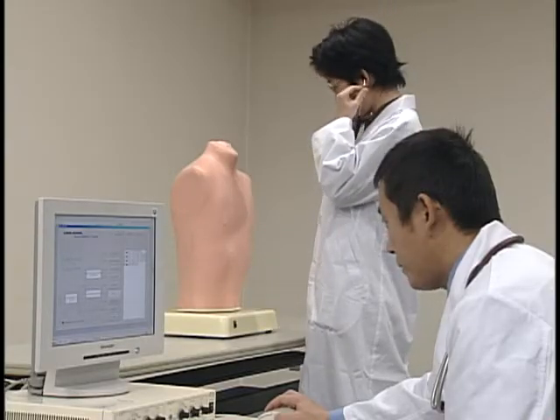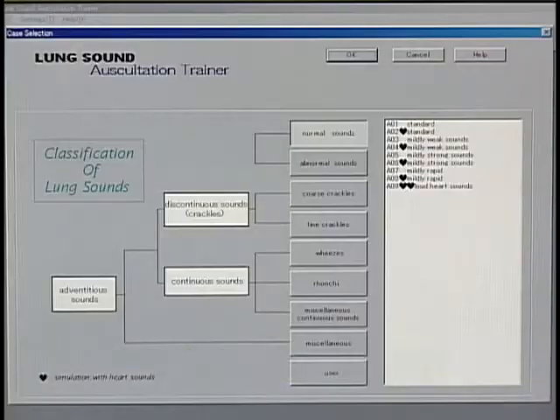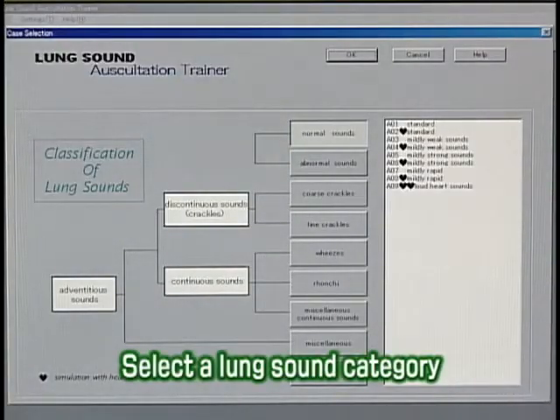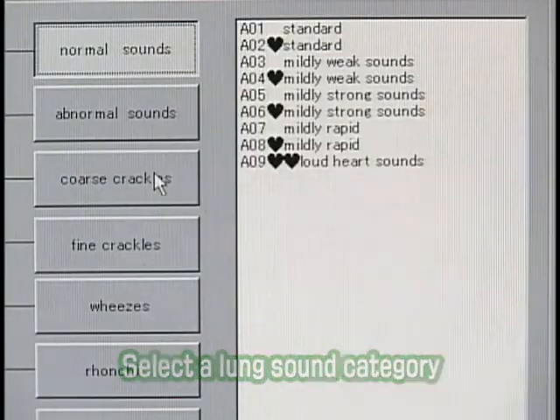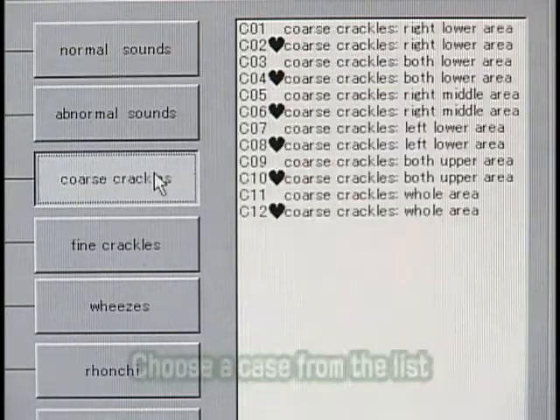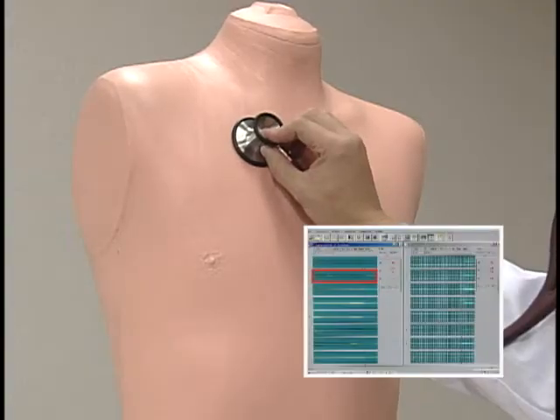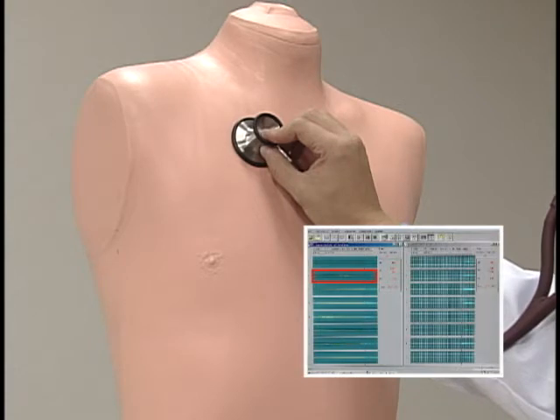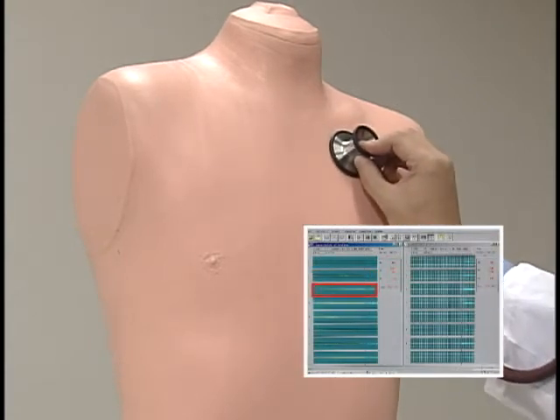Let's try it out. First, select the lung sound category, then choose a case from the list. Following the examination, you can discern the lung sound asymmetry, type of adventitious sounds, the location, and other aspects.